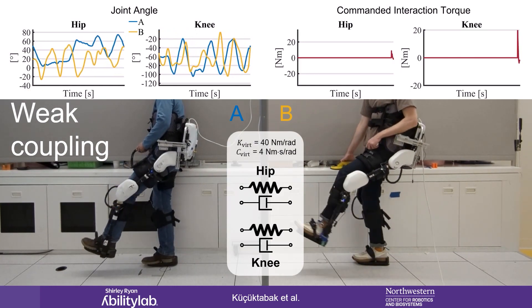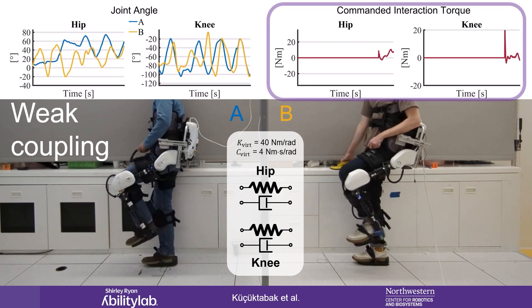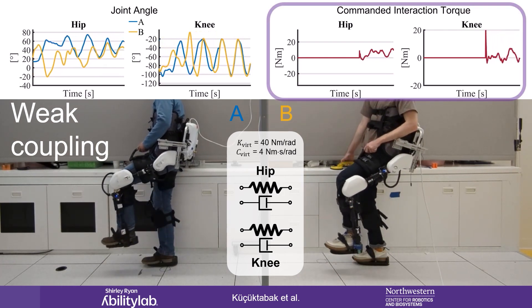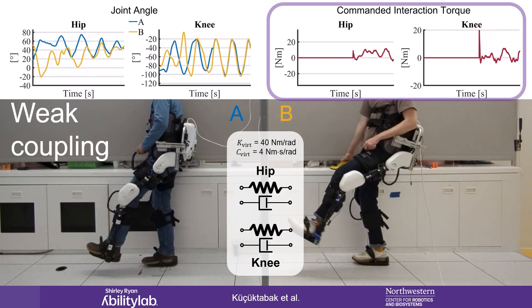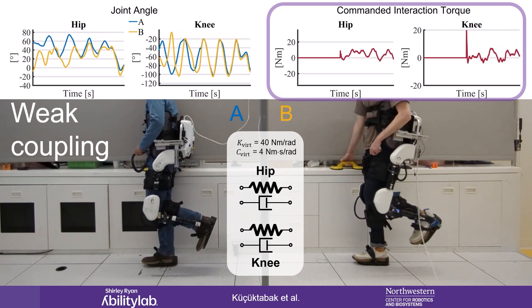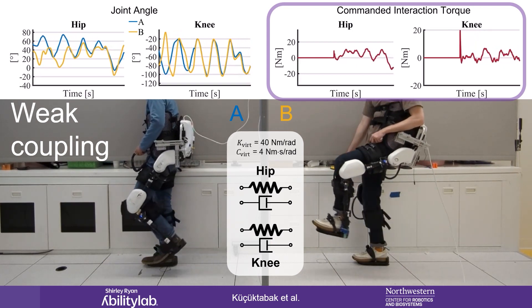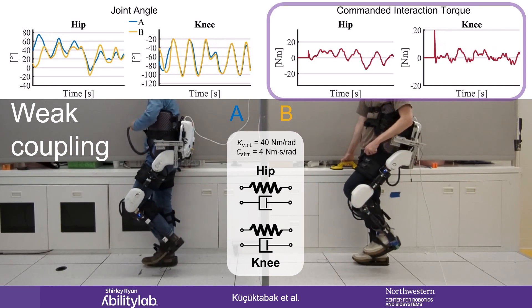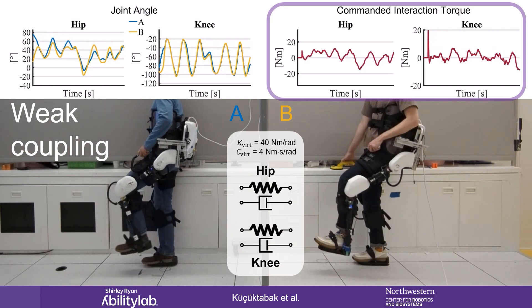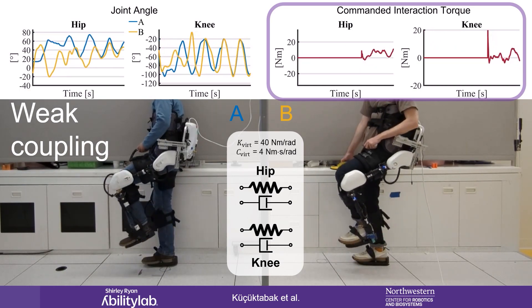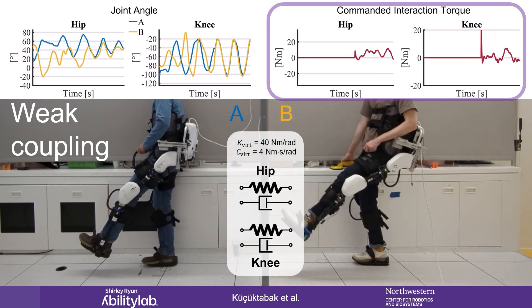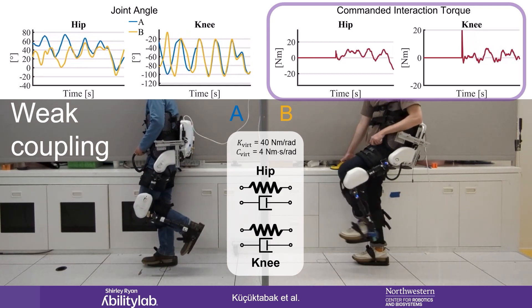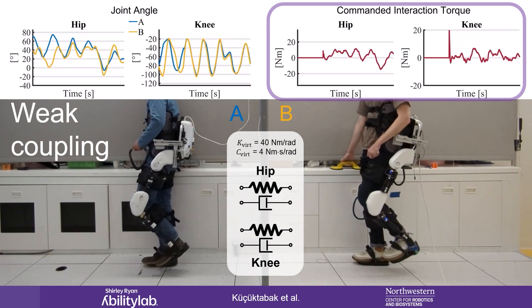The framework we've developed allows us to create virtual physical coupling between two exoskeletons. Here, we render weak spring and damper elements between the hip and knee joints of the users. Both users are still able to move independently, but can physically influence one another through the compliant virtual coupling. The interaction torque between the users changes depending on their states and the properties of the coupling.